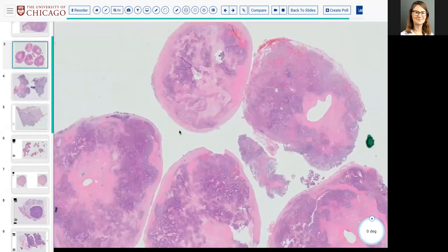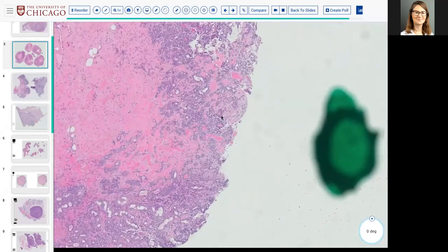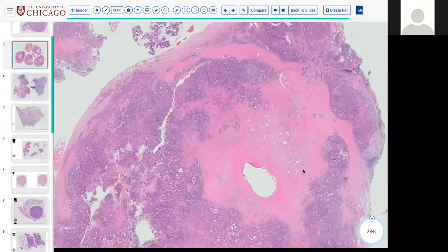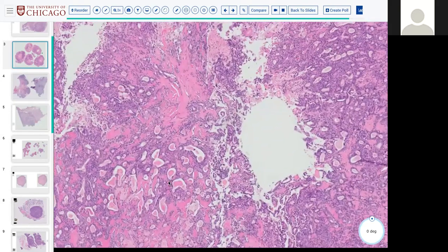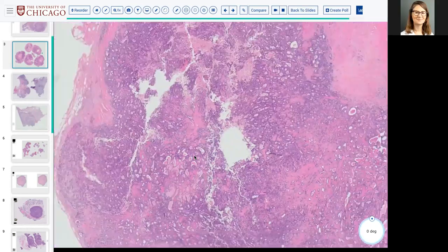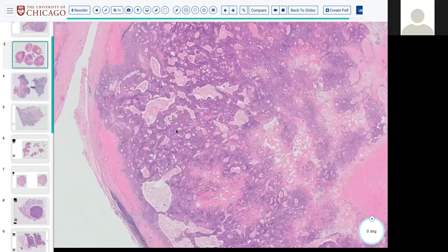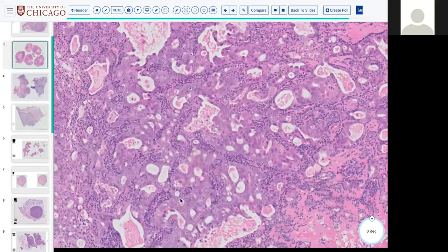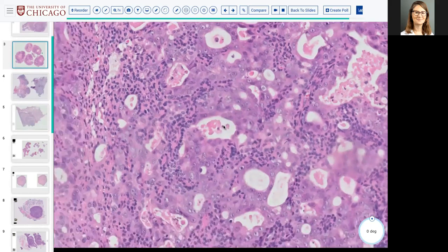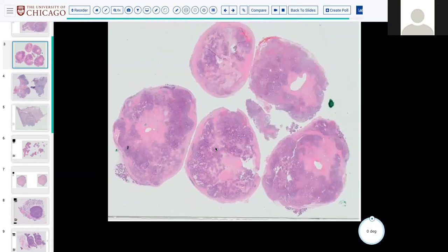Okay, so I kind of gave away the answer here, but did anybody see anything unique or different in this tumor that might be worthy of mention? Like in the middle, there is kind of a nodule, a hyalinized nodule. And here the ducts or ductules, the cells reveal more nuclear pleomorphism. They are enlarged. I'm able to see prominent nucleoli, even without higher magnification. I believe it's invasive. It's not well circumscribed comparable to the prior slides.